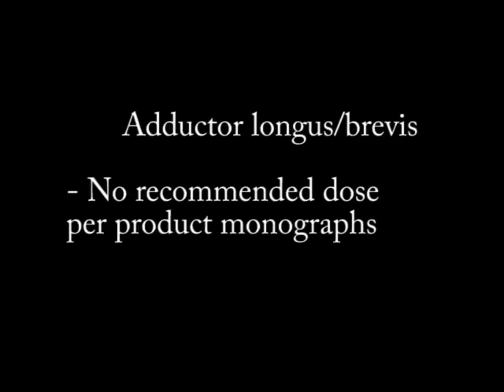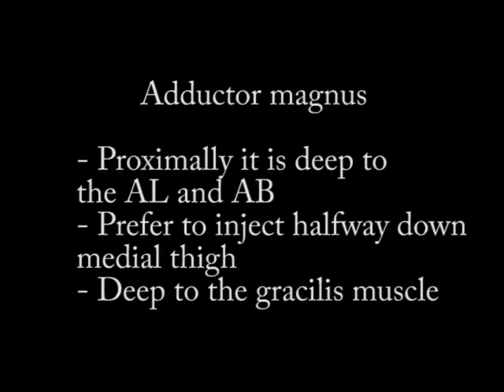When it comes to dosing for the adductor longus and brevis, there's no recommended dose per the product monographs, whether we're looking at Botox or Dysport or Xeomin, but they're large muscles, so bear that in mind when you're dosing. So now we're going to move on to the adductor magnus.